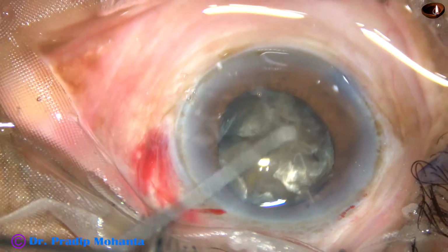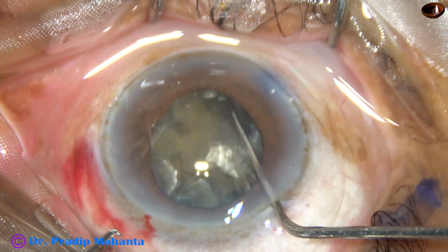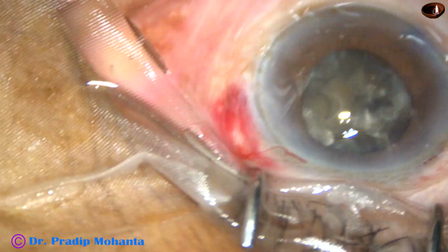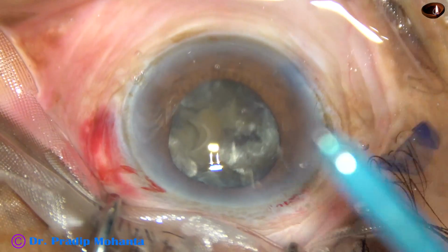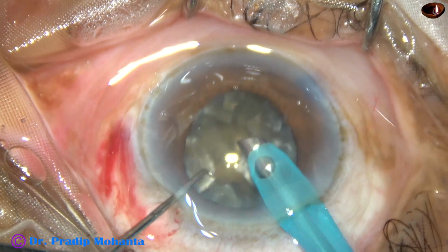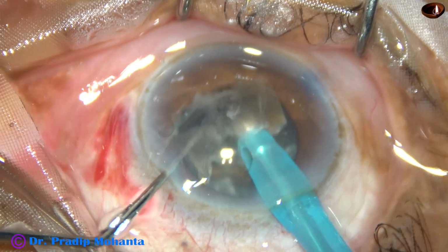After chopping, I have come out, and this will give nice protection to the corneal endothelium. One more thing I'm going to do at this time is decrease the exposed part of the phaco tip, rotating the sleeve and decreasing the exposed part, because for emulsification I don't need a lot of ultrasonic energy. Ultrasonic energy has been used to divide the nucleus, but for emulsification of each fragment I need less ultrasonic energy. So I just decreased the exposed part and I am emulsifying each nuclear fragment.